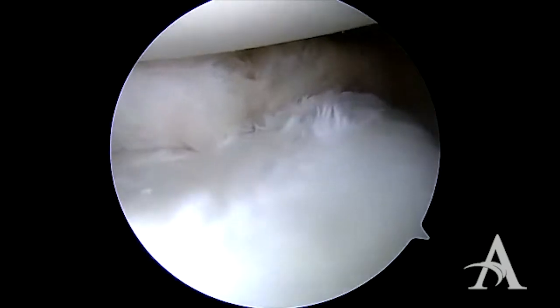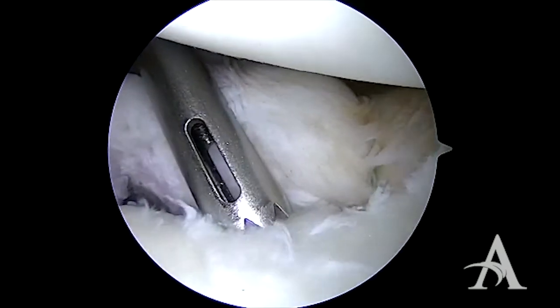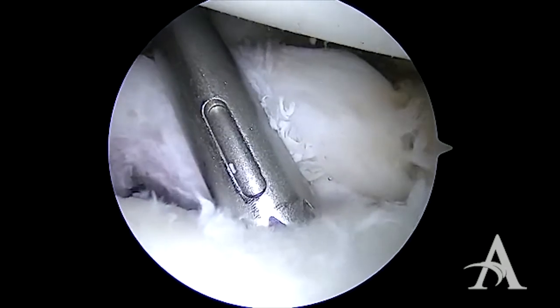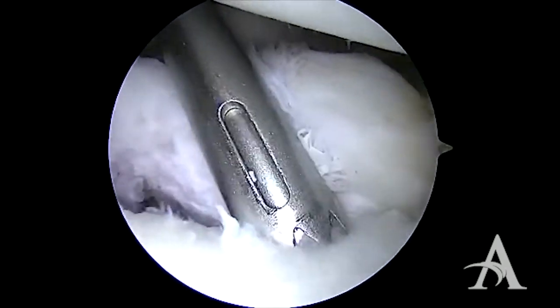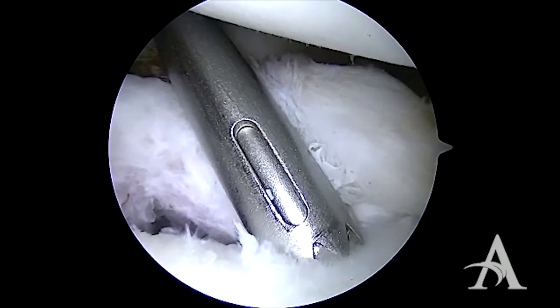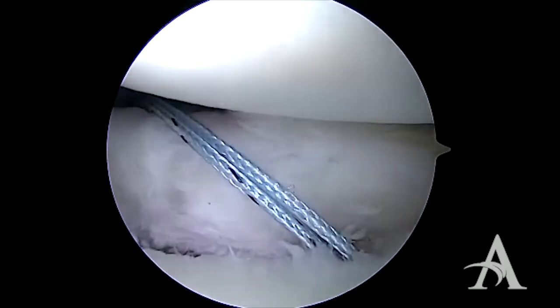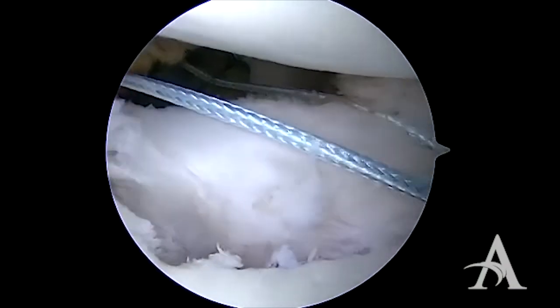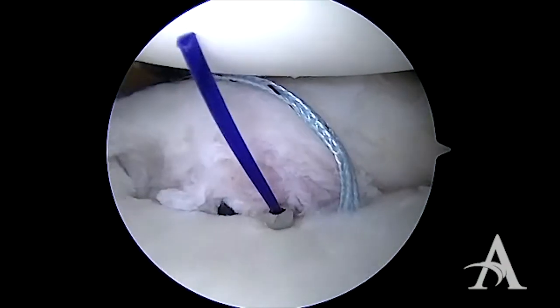We then proceed to place anchors in similar fashion, working our way superiorly. The drill guide is brought in through the anterior inferior cannula. If it is difficult to reach low in the glenoid, a trans-subscapularis percutaneous portal can be used to place the anchors.